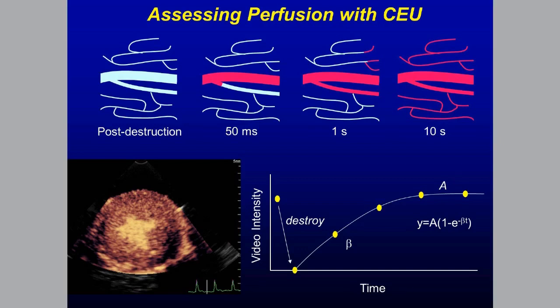The second thing is that attenuation is still a problem sometimes if you use too much contrast agent. And one of the things that is really nice to be able to use when you have attenuation from the LV cavity, to see the far field wall motion, is some of the more advanced bubble-specific modes. Instead of just harmonic imaging, going into the multi-pulse modes like power modulation or pulse inversion imaging, the low MI contrast imaging modes. Those are not really available on the 3D systems, mostly because you need to shoot several pulses for every line in order to get that data, and it's just not conducive to 3D imaging. So right now, I still prefer looking at wall motion with 2D rather than 3D, just because the spatial resolution is better.